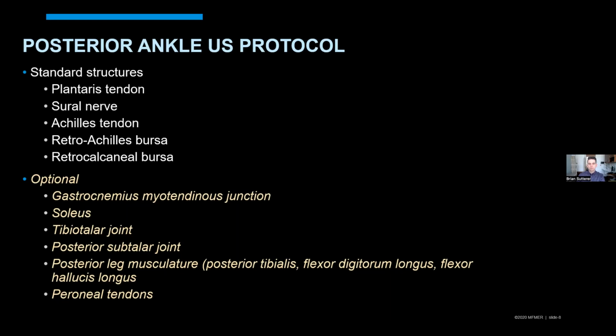So I do a quick sweep, proximal to distal, of the medial tarsal tunnel. If it's normal, then I simply get a still image of a short axis. Now I've gotten pretty much everything you need for a complete evaluation. I've gotten joint, nerve, and vessels, and plus I'm looking at the differential diagnosis. So a short axis of the medial tarsal tunnel is in my Achilles and my plantar hindfoot protocol.